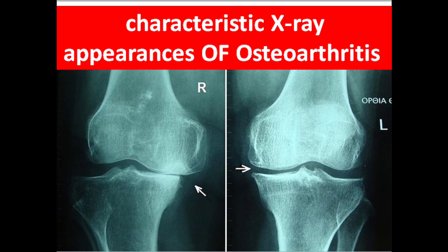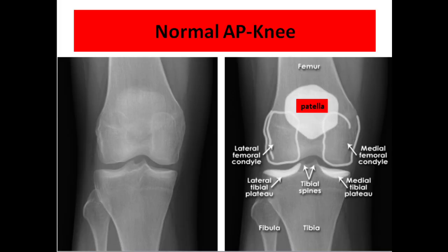Hello everybody. Today our video is about the characteristic X-ray appearances of osteoarthritis. Osteoarthritis can affect synovial joints; the hands, wrists, hips, knees, and feet are most commonly affected. First, we will take a look at a normal X-ray — for example, a normal anteroposterior view of the knee.